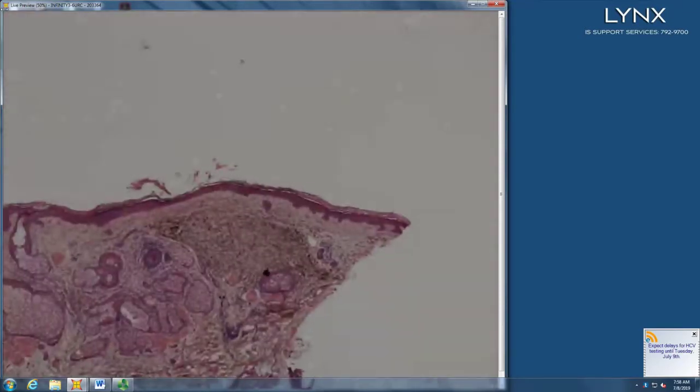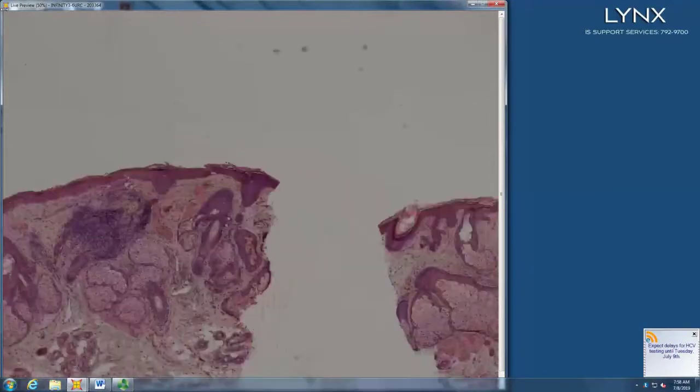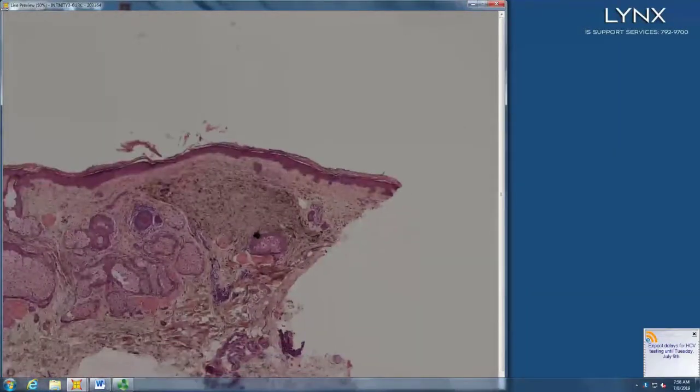So there's some pigment, normal brown. Yep. Does it have only pre-existing collagen, or does it have its own unique sclerotic collagen? I think it's its own. And is that a good thing or a bad thing? It's a good thing. So this is probably blue nevus. Very good.